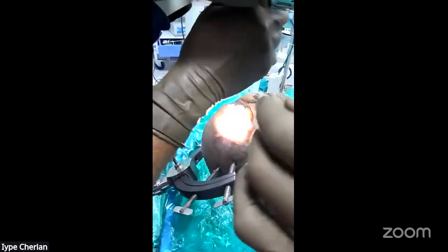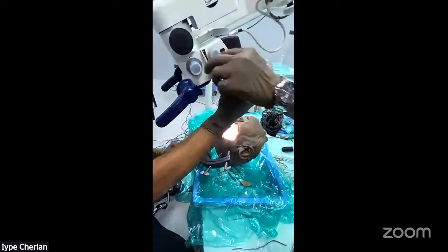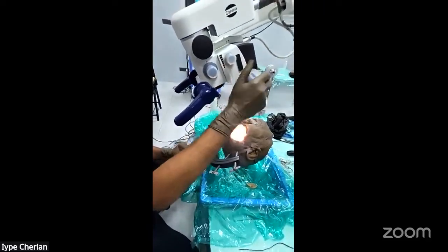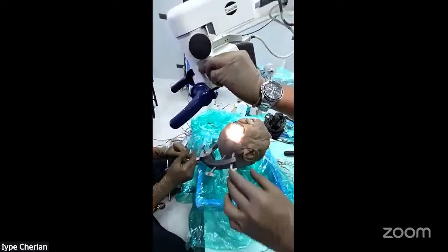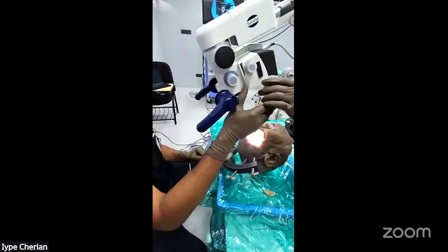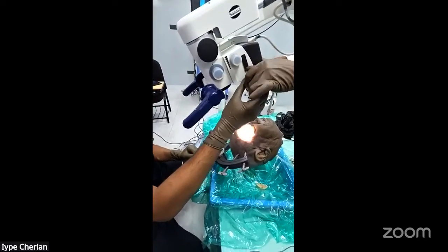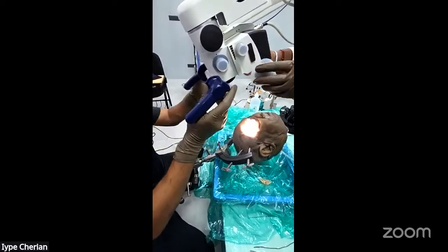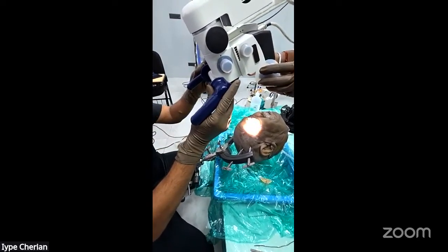third, fourth, It's a magnification. V1. No, not the one. This is focus. Yeah, that's a focus. Zoom. Can you increase the zoom? Yeah, I will. It's the zoom. More. Yeah. Can you bring? Yeah. Then bring it down. Bring it. No. Bring I it. will focus to. Focus and then bring the microscope a little bit.